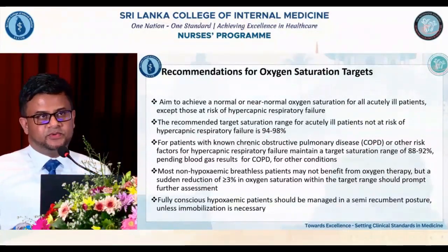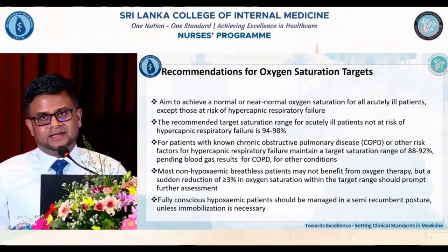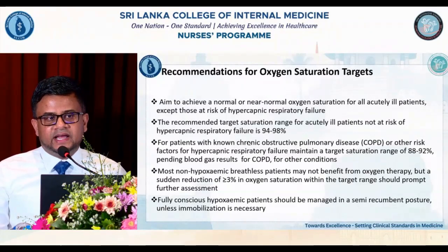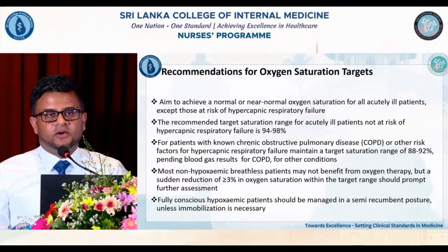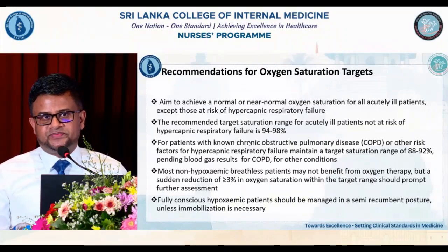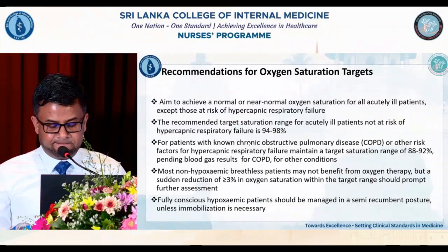And most importantly, as Dr. Gunasekera said, when you are following the chart, see whether the patient's oxygen saturation is going down by more than 3%. If that is so, escalate it to the relevant medical officer or the consultant, or whoever the medical team involved is, because from that point the patient needs escalation of oxygen therapy.